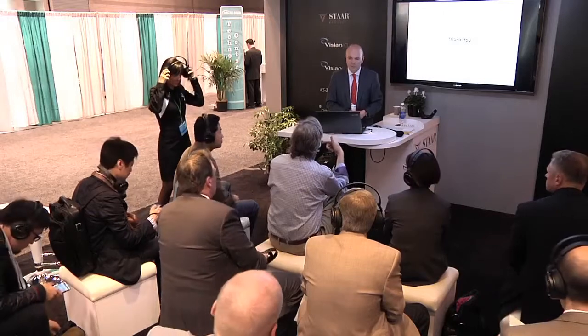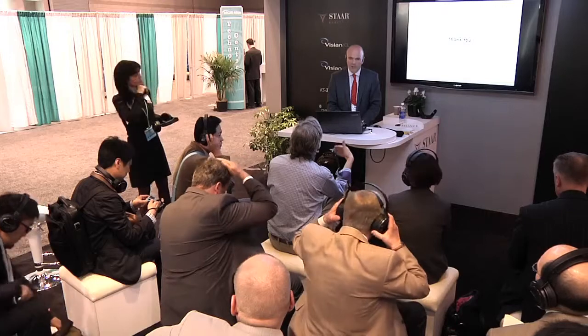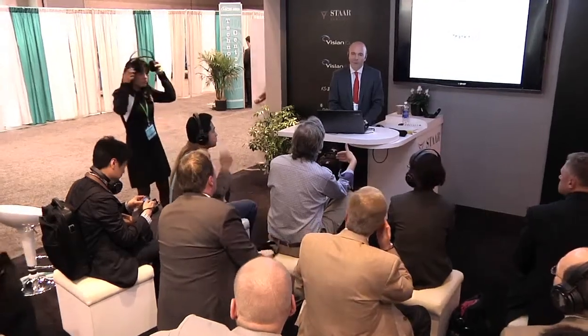So what do you think is the correlation of the anterior chamber depth involved? If you have a deeper anterior chamber? Yeah. Well, finally, what you are trying to predict is the whole size of the anterior segment somehow. And logically, we should think that the posterior magnitude of the sulcus to sulcus diameter should correlate with big pre-iris structures. So everything goes together. I mean, if you've got a wide angle-to-angle and a wide ACD, it sounds logical that the sulcus to sulcus should be wide as well.